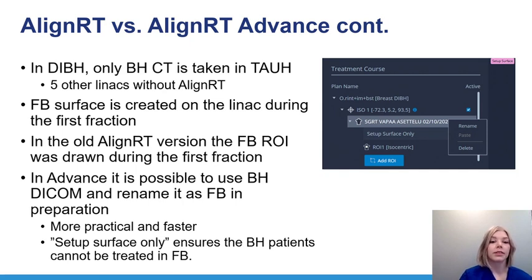By choosing the setup surface only, it ensures that we can't accidentally treat the breath hold patient using the free breath reference. Here you can see in the image, setup surface only. And if you're wondering about the plan name, it's shortened Finnish. It means right breast with lymph nodes and a booster, if someone was wondering.